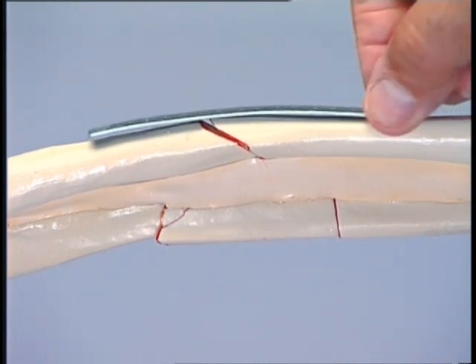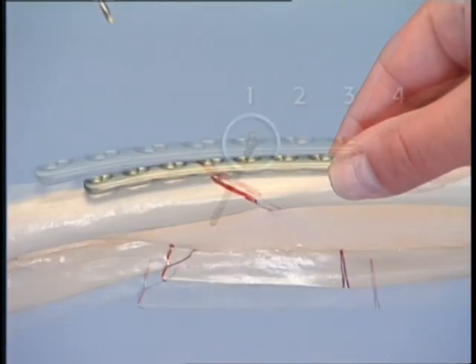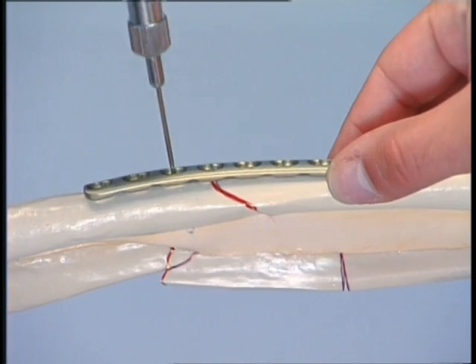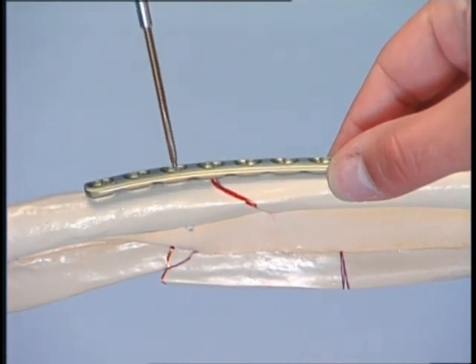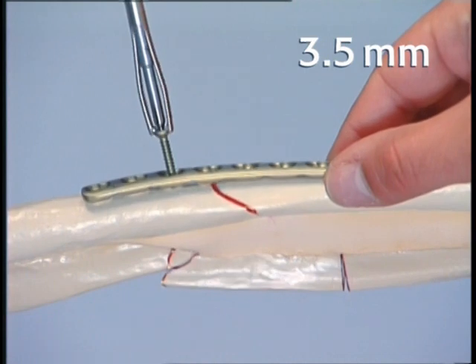Choosing an 8-hole LCP requires that the appropriate plate hole already be selected for the interfragmentary lag screw that will be inserted across the oblique fracture. Three holes will lie over the proximal fragment and four over the distal fragment, with one hole left free for the lag screw. The first screw hole, proximal to the fracture and close to the obtuse angle, is drilled neutrally with the 2.5 mm drill bit through the universal drill guide. The screw length is measured with the depth gauge, the thread is cut with the 3.5 mm tap, and the plate is fixed with the first 3.5 mm cortex screw.